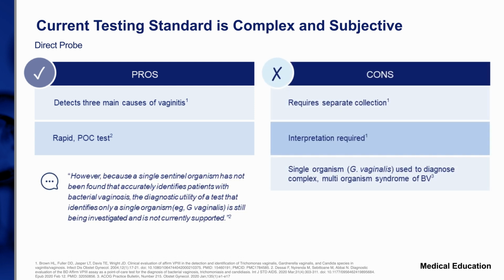However, it requires a separate specimen for tests such as wet mount analysis and other tests as culture. In addition, it was developed for use in the physician's office as well as in the laboratory settings. But clinicians, particularly in lower prevalence populations, may have difficulty interpreting these results.